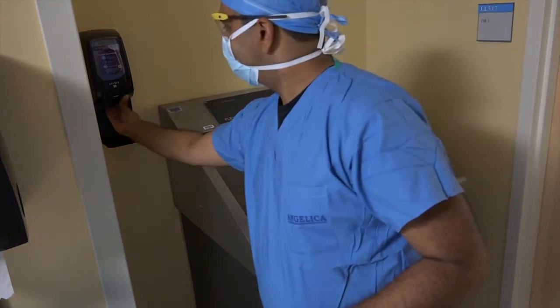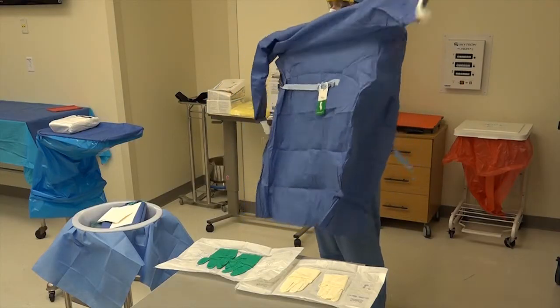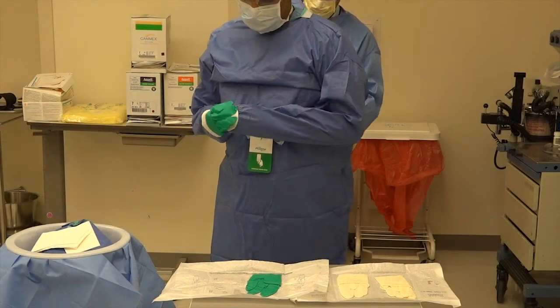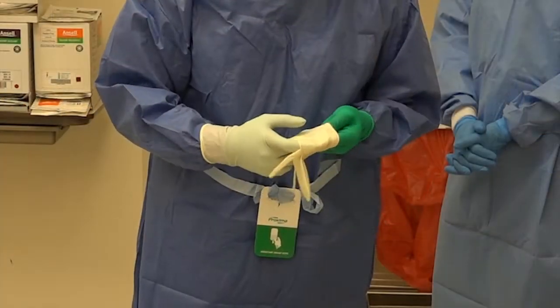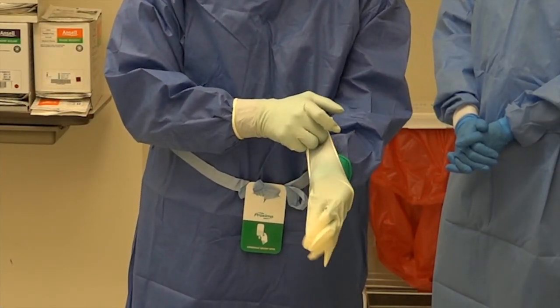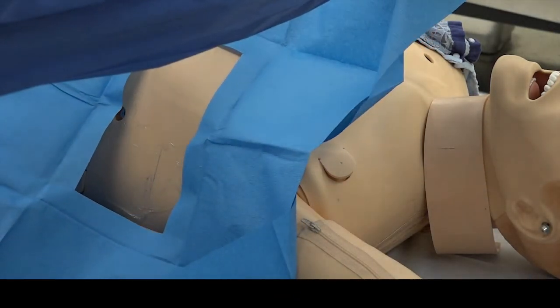Now, sterilize your hands thoroughly. Don full barrier protective equipment. Make sure you use double gloves with green gloves on the inside and brown gloves on the outside. Place drapes across the chest to outline the sterile field.